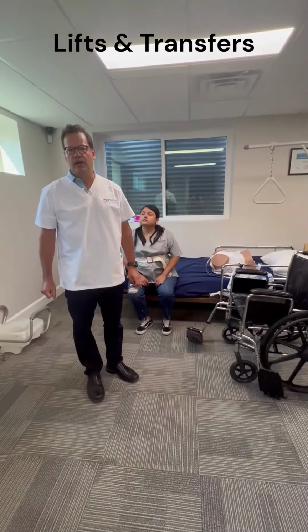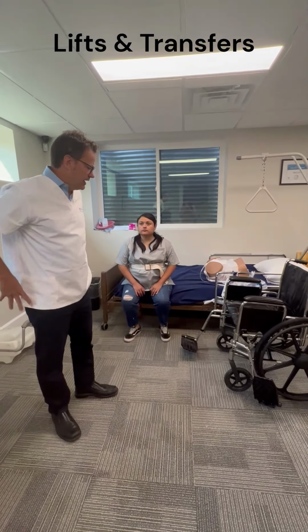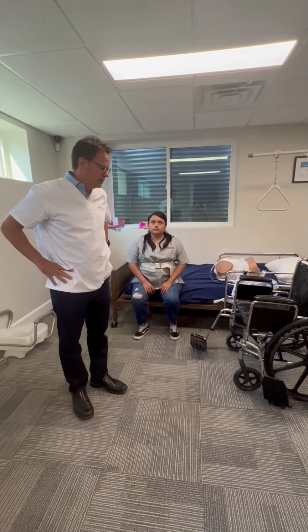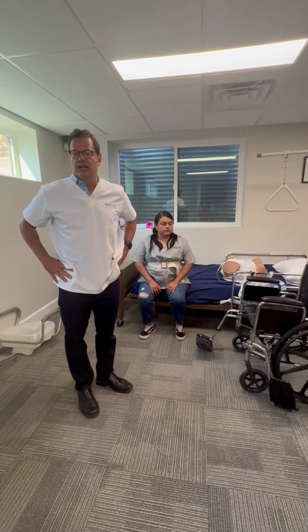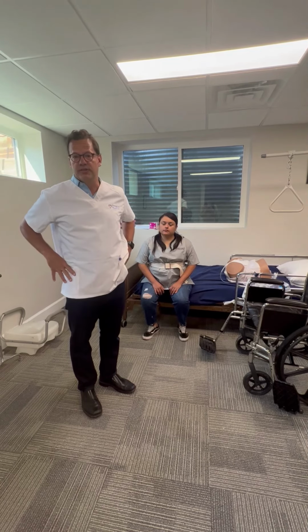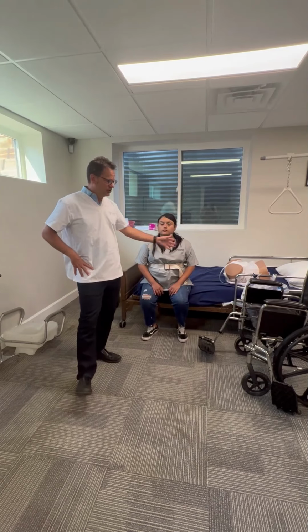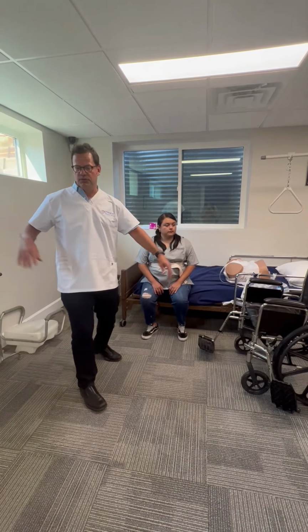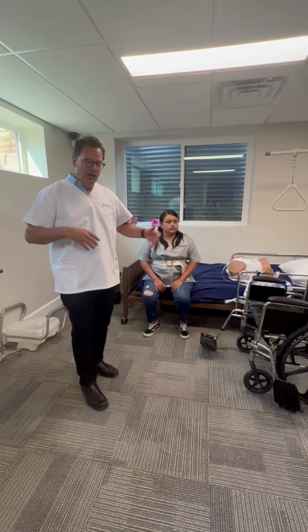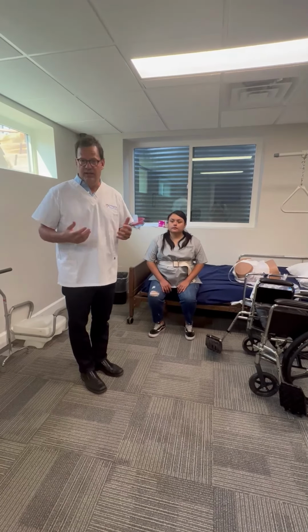We are back. We now want to demonstrate an actual transfer. And what I'll say about transfers, which I think is awesome, is that you only have to learn one transfer. And for any transfer you make, the skills are the same. So whether you're going from a bed to a chair, chair to a bed, chair to a toilet, toilet to a chair, all of the transfers are going to use the same skill set.